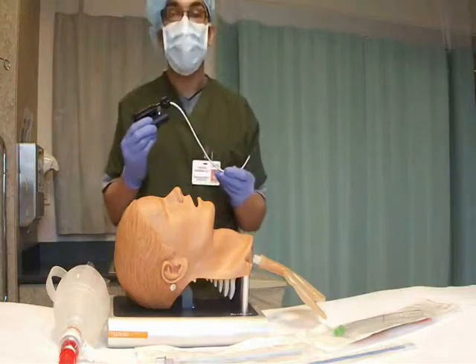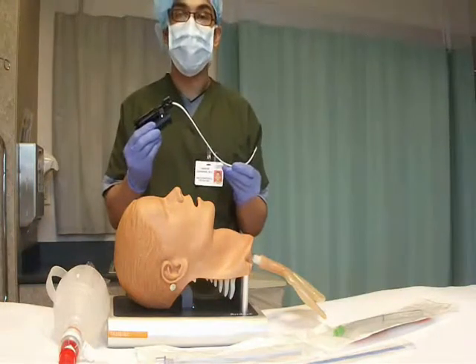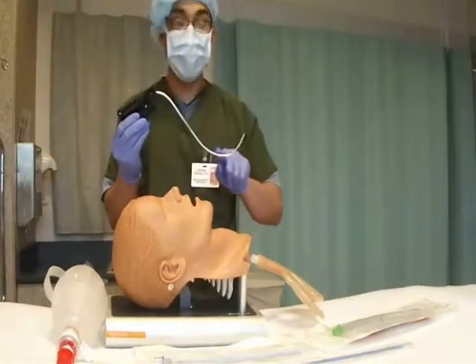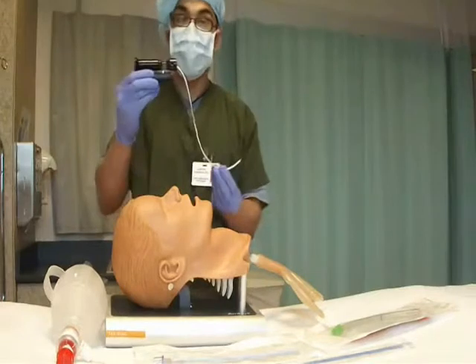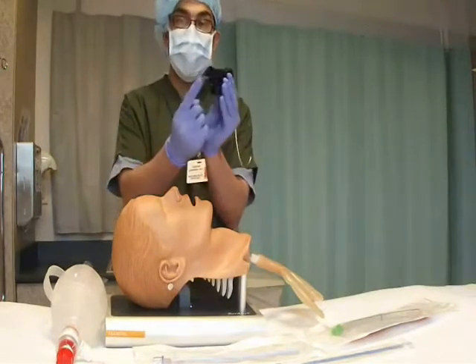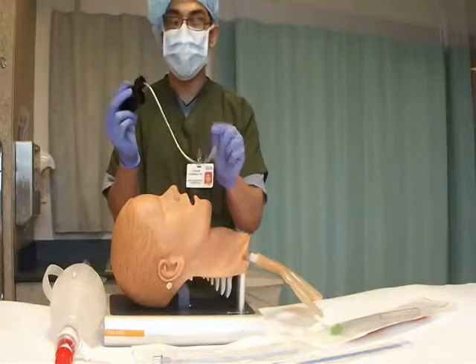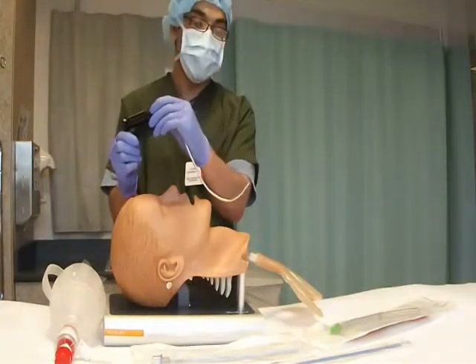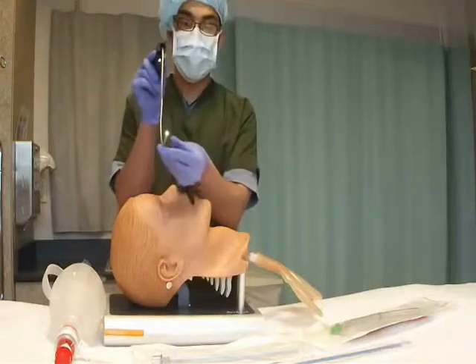A rigid fiber optic scope (RFS) is a J-shaped metal stylet with fiber optic fibers running through it. On one side is the eyepiece, on the other side is the camera. A battery handle is the source of the light at the tip.